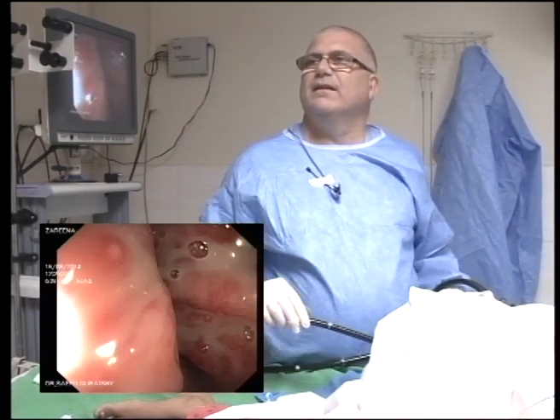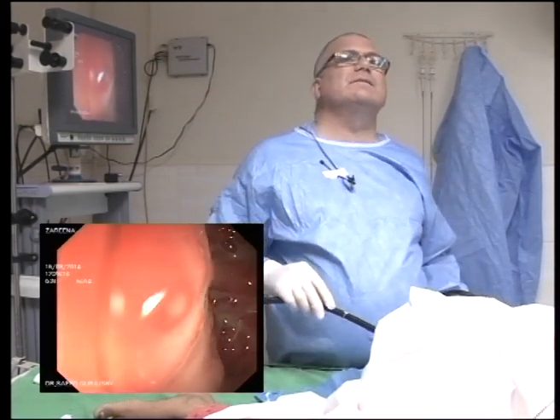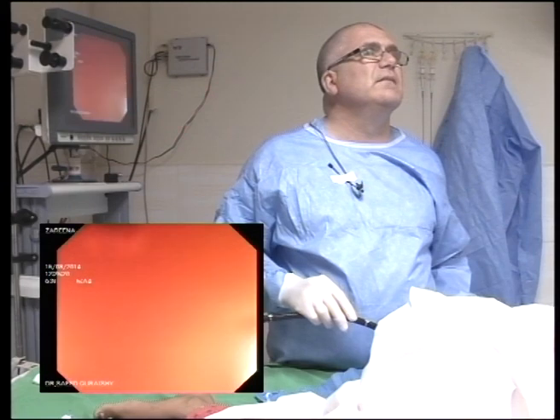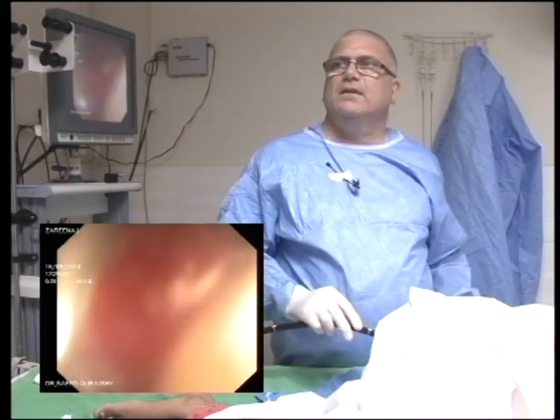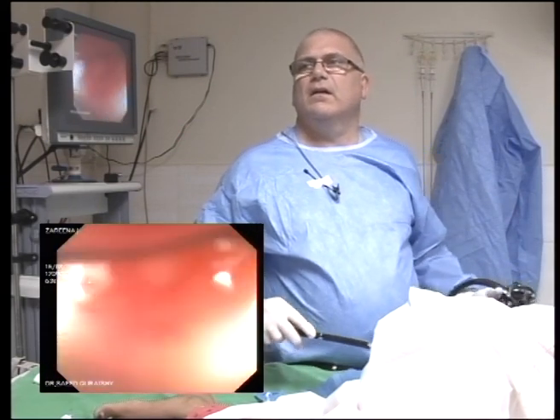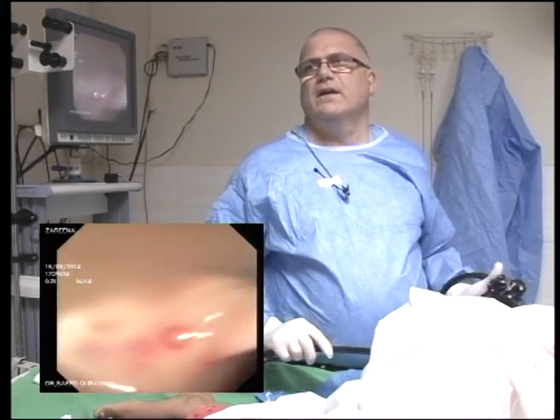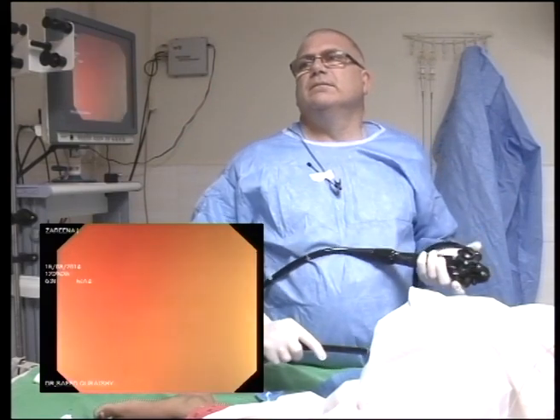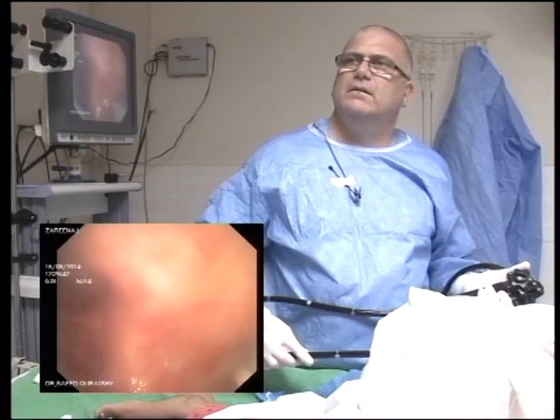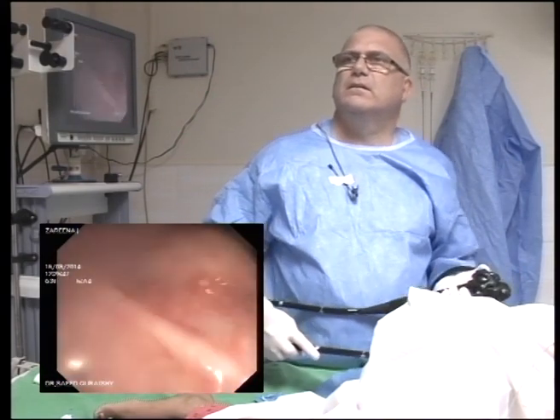No, it's definitely not. I don't know what the rest looks like, but this is something which can be seen apart from inflammatory bowel disease in conditions like ischemic colitis. In addition to inflammatory bowel disease, this type of appearance can well be caused by ischemic bowel, because I've seen quite huge punched out ulcers in vascular obstruction.